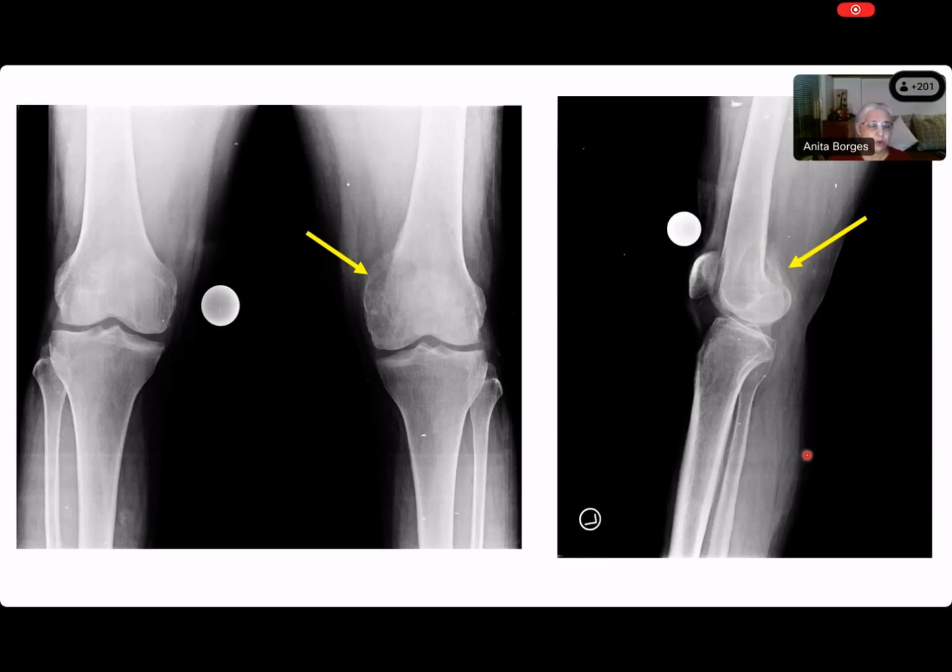So there is something that looks almost like, at least in this left-hand side X-ray, you might even say that there is a soap bubble appearance. Yeah. You can also see it because the trabeculations within the lesion give this appearance of a soap bubble. All right, so this is a mature skeleton. It has this soap bubble-like appearance. It's a narrow zone of transition. It has reached the condyle, almost the articular surface of the condyle, and it has a soap bubble appearance.